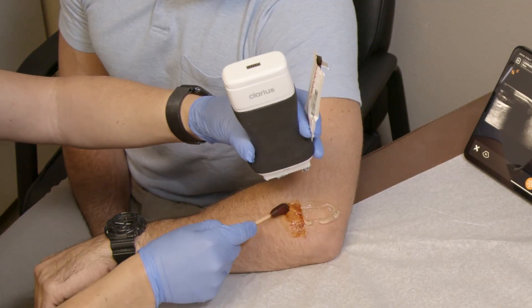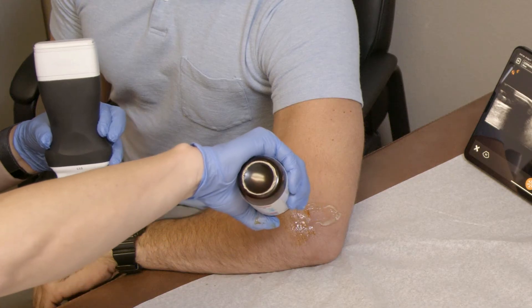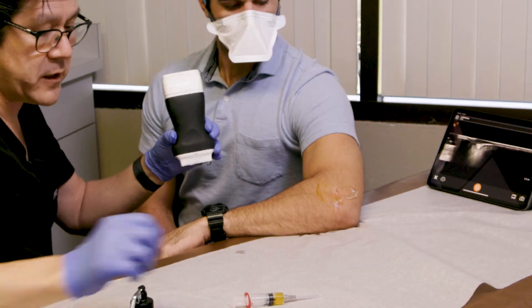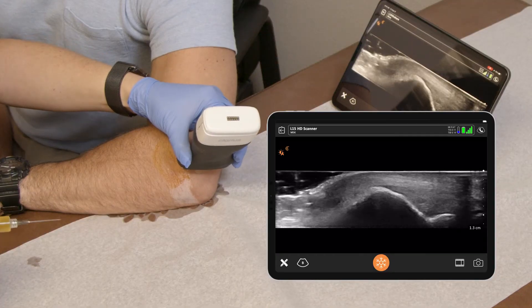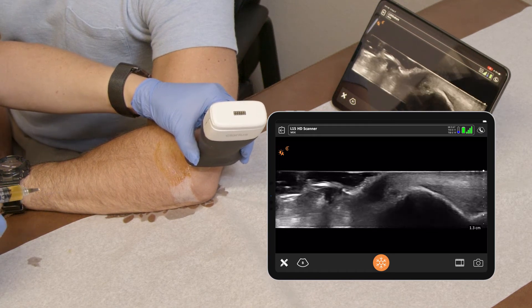My entry point's going to be right here. We're going to numb it up with a cold spray — ethyl chloride. Keep the transducer away from the area, as this ethyl chloride can actually damage the unit. Now I'm going to get back in position to see where we want and identify our region.